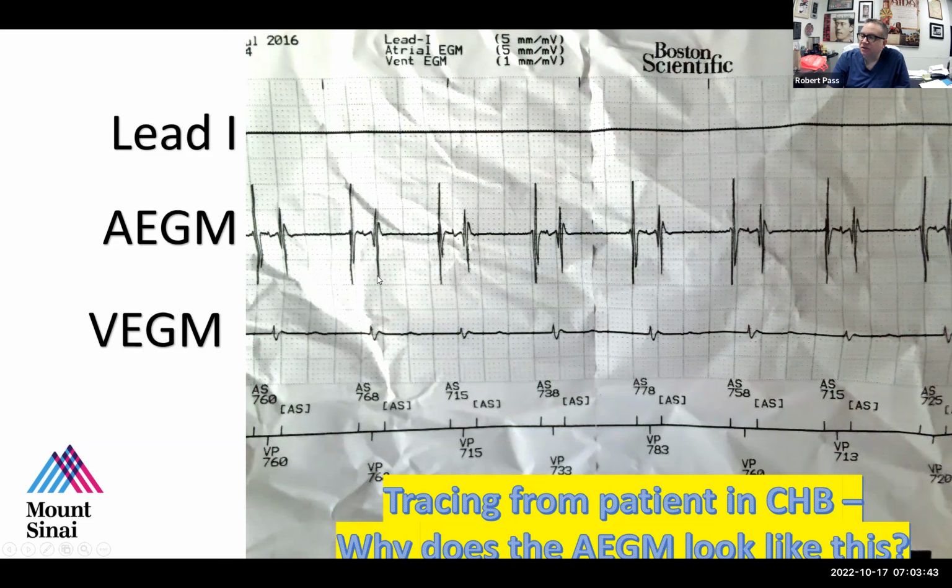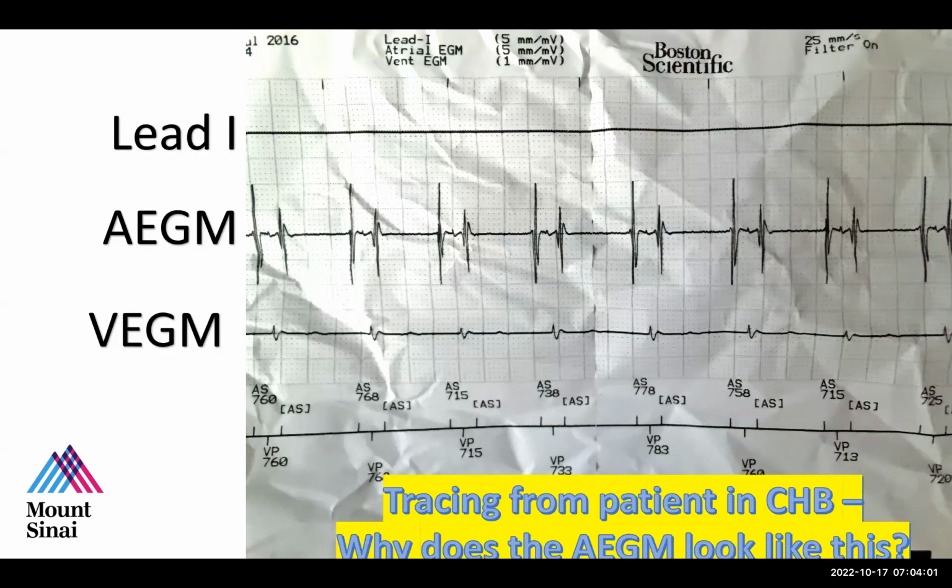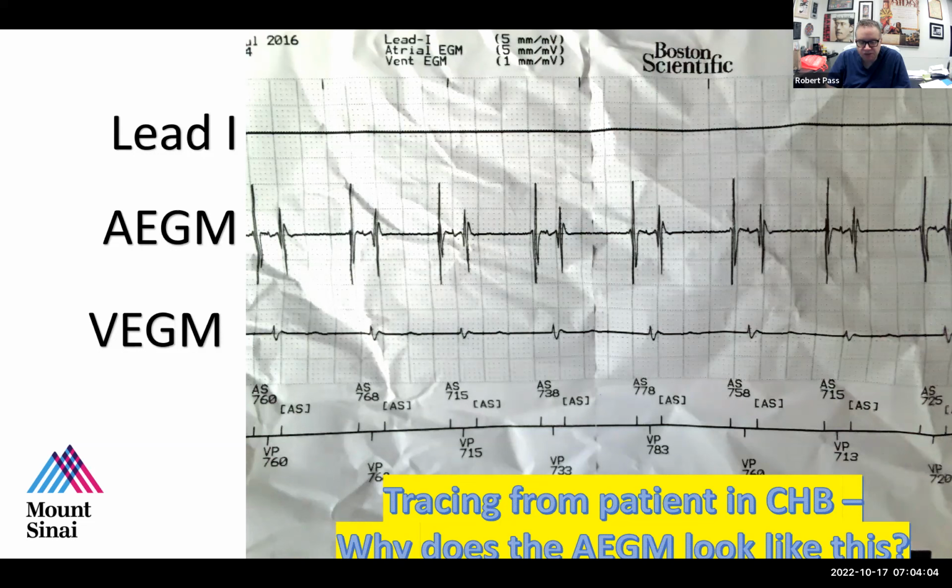Where do we normally place transvenous leads when we're putting an atrial transvenous lead in? What chamber or what part of the atrium is the usual target for this lead? In the right atrium. True, but is there a particular location in the right atrium where we normally put the lead? Like in the high right atrium. Yeah, we do usually try to put it up high in the right atrium, but there is a particular location. Let's see, I'll cross over to Maya.